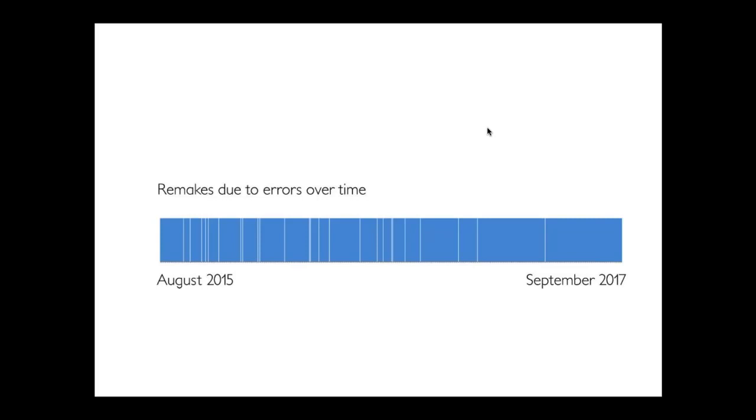So if you remember, I did significantly reduce the number of try-ins in my practice, but there were remakes because I was significantly reducing try-ins. Now, is that equivalent? Did I win? Did we lose? It's a mathematical issue.